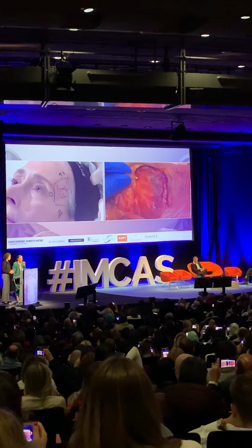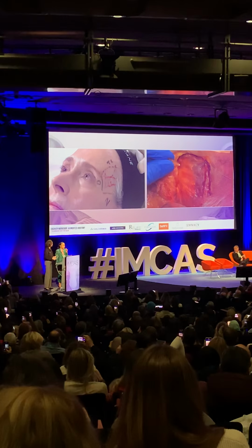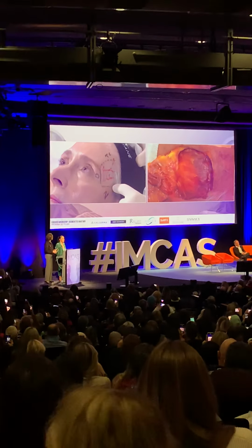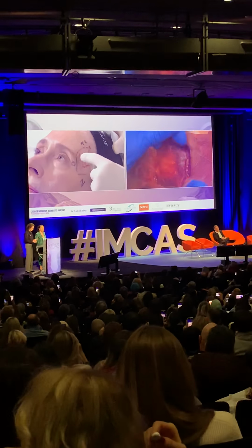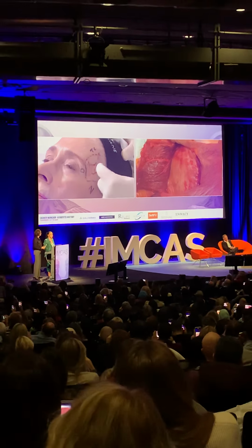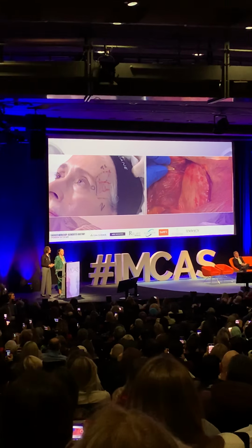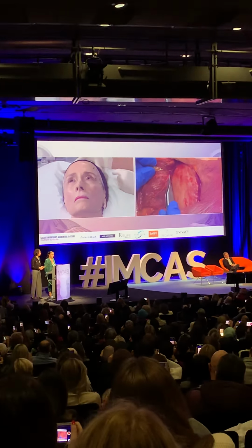And last, Patrick, for the product. Patrick? Yes? And then, what is the characteristic of the product that you choose? Yes. If you inject deeply? If I inject deeply, because I want to lift all this area, and because I will be under the temporalis muscle, that is a very strong muscle, I need a product with high cohesive properties. So I will use the highest lifting capacity product on the market, and I will use Ultra Deep.